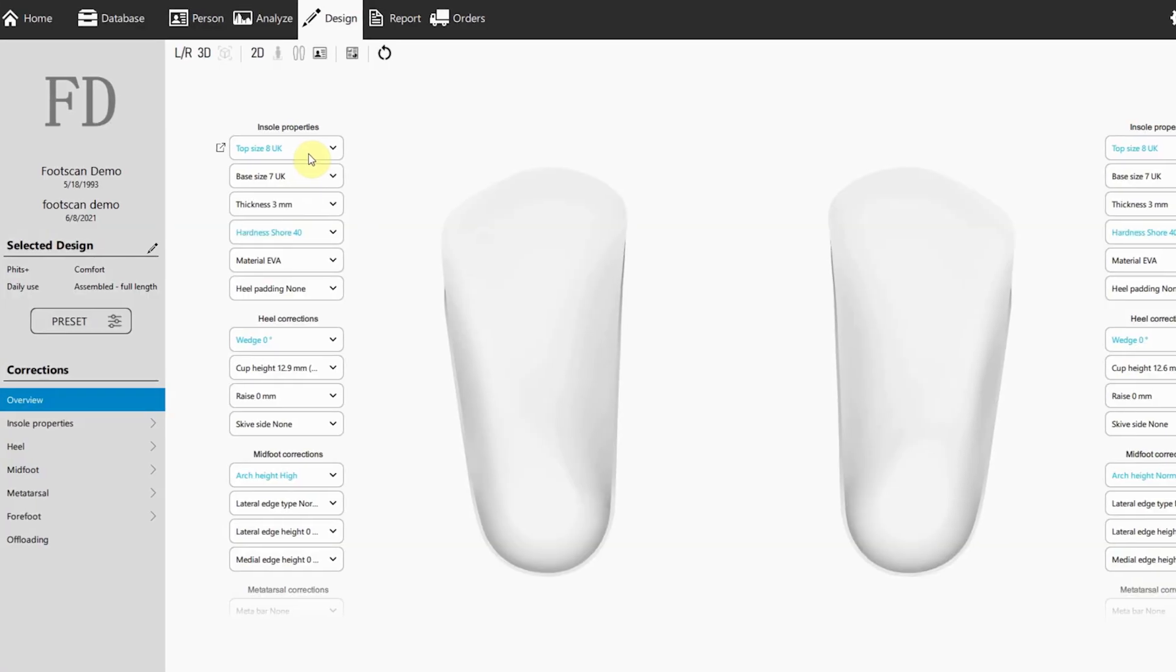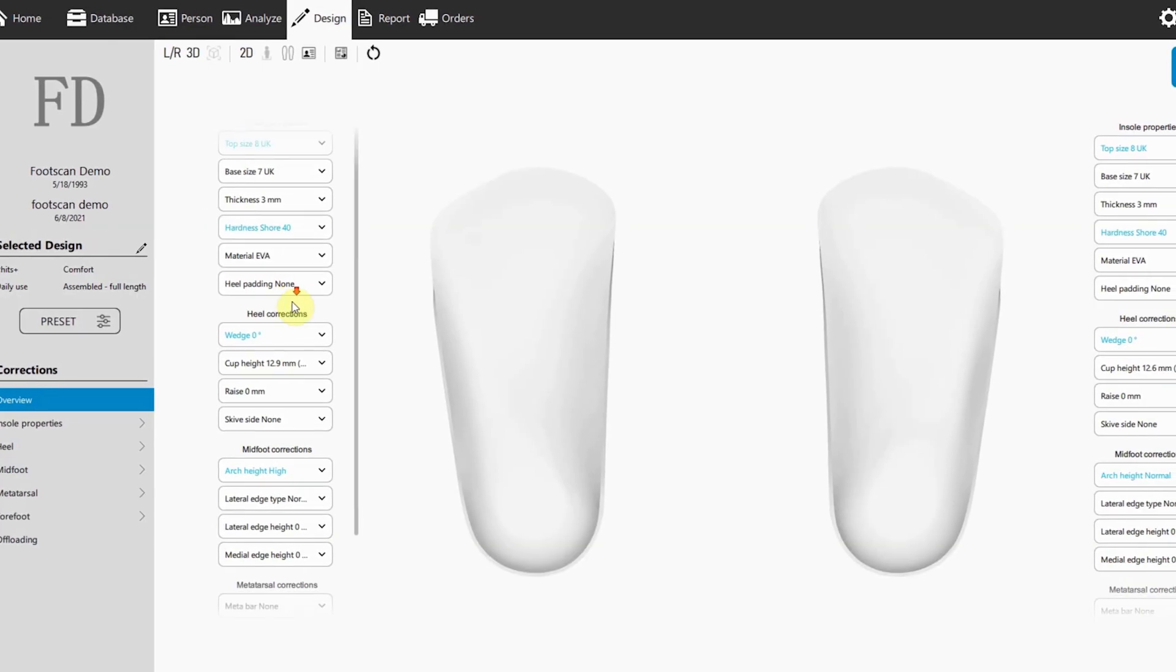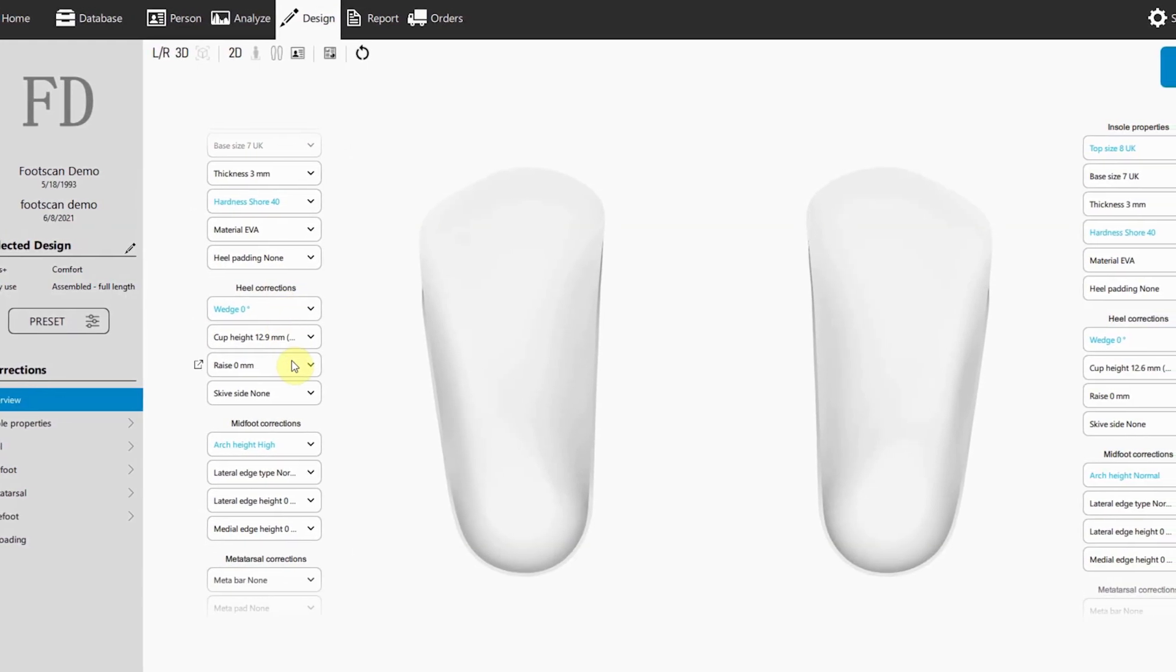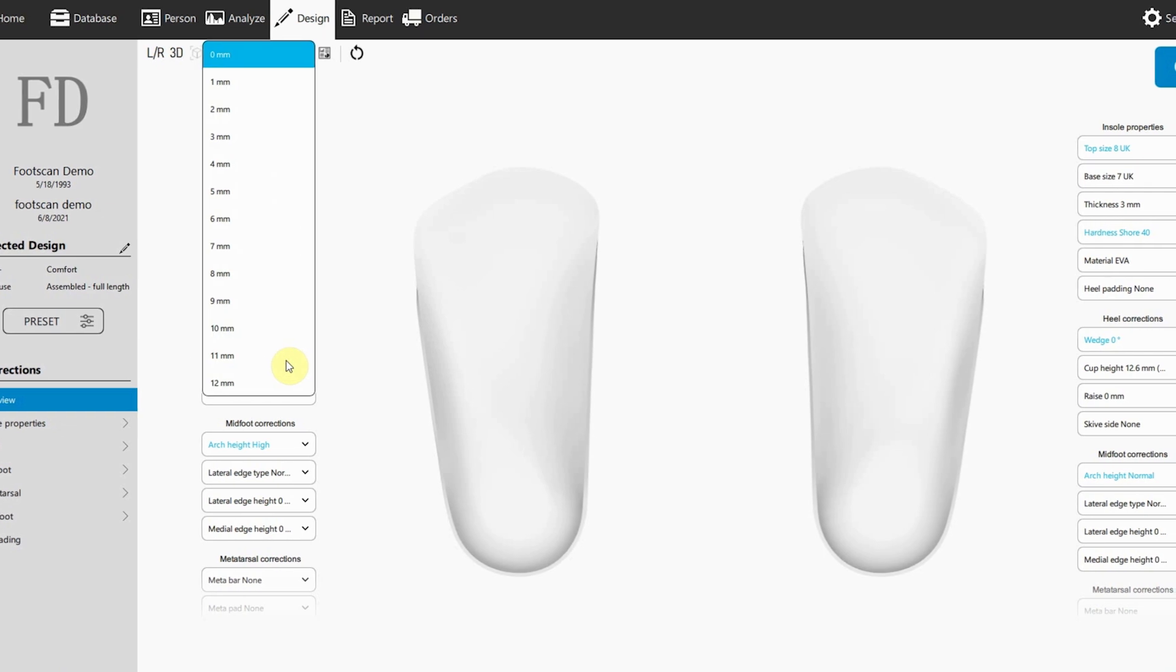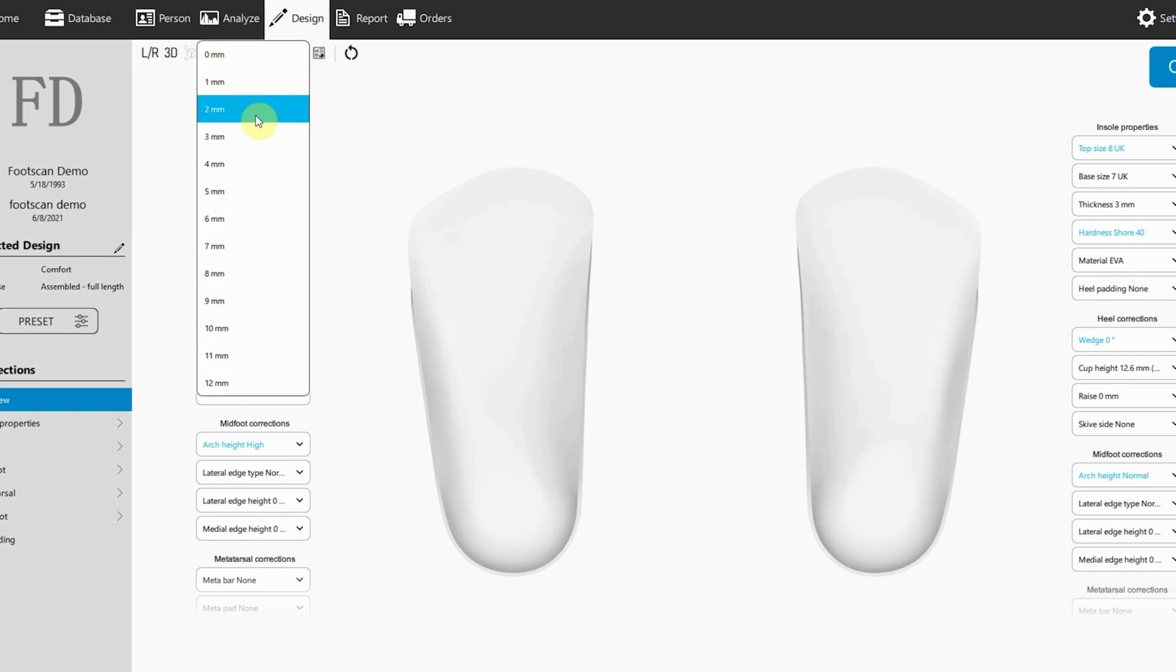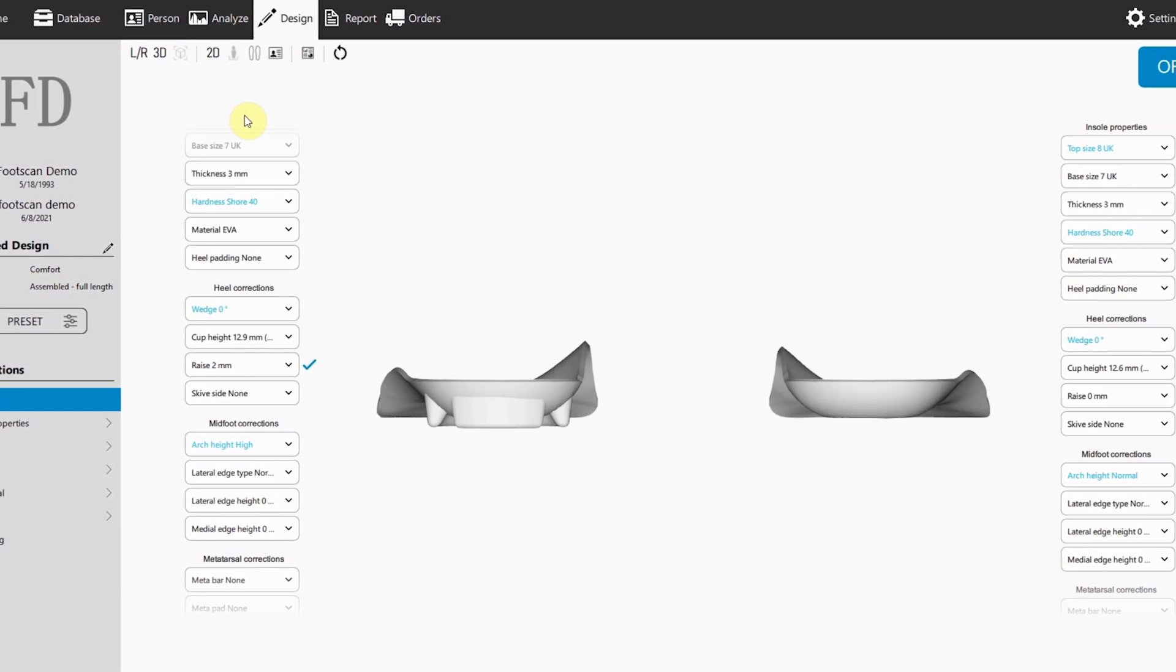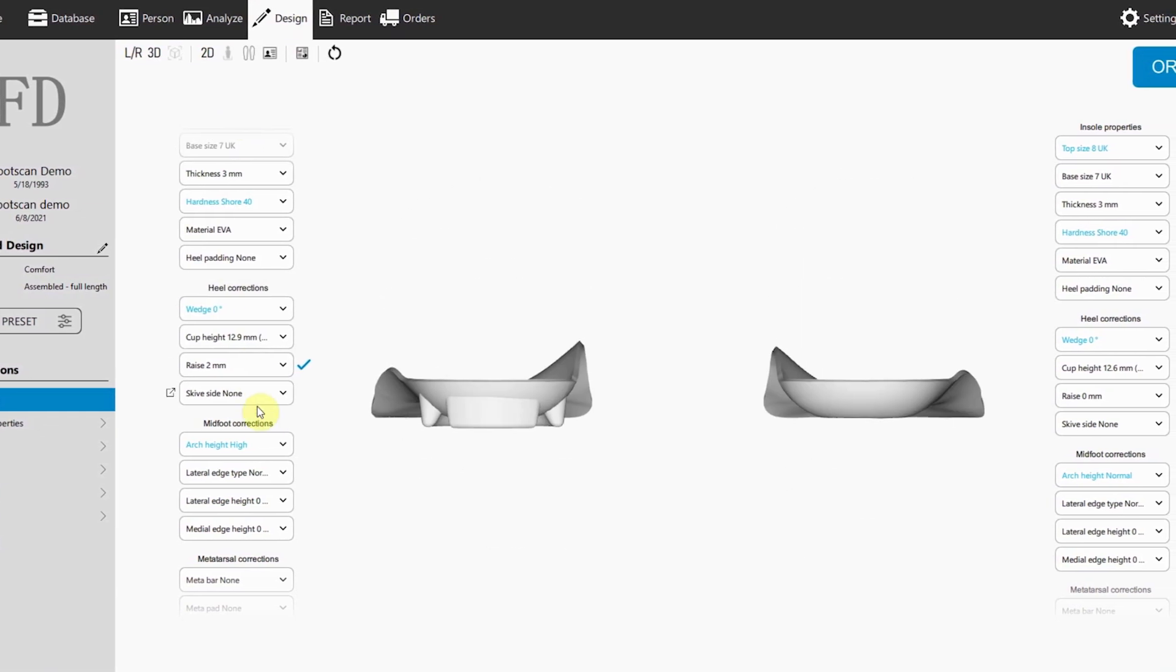First up, our design wizard has a fresh new layout. The newly added overview page now features handy drop-down fields, allowing you to design with speed and precision.